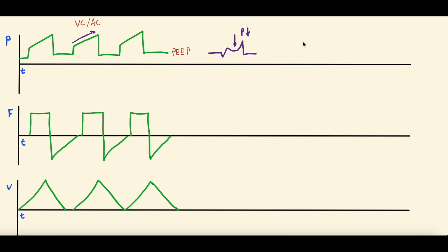And what's happening in flow starvation, and you can picture this, is that the patient's respiratory effort, that negative intrathoracic pressure that results from them inspiring, outpaces the flow that is filling up the lungs and being delivered. So negative, they start to take a breath. Breath starts to be pumped in, but they are inhaling faster than the flow is being delivered. So you see this kind of negative inflection as the flow is being delivered, and then the breath's done and it goes back to normal.